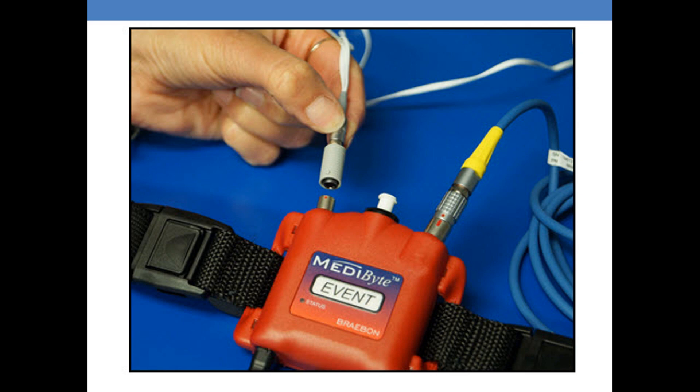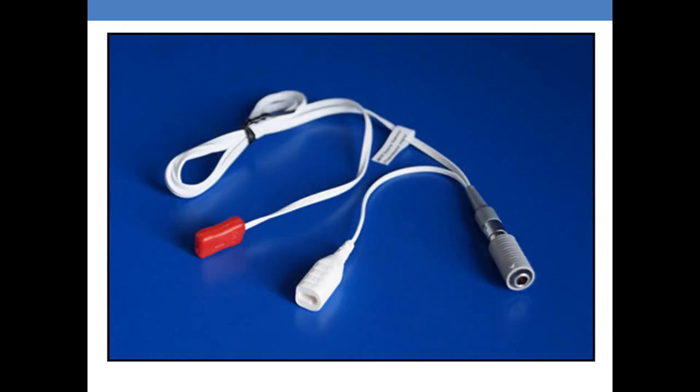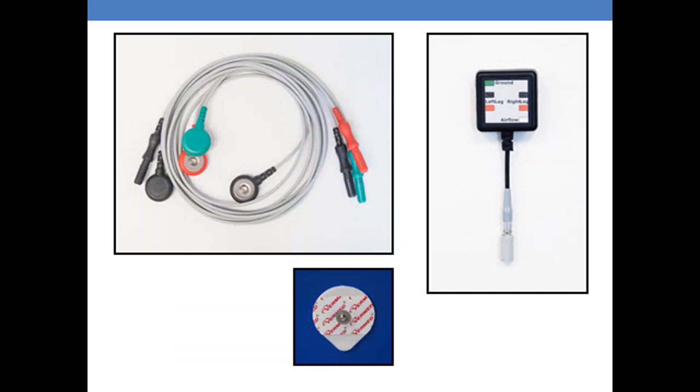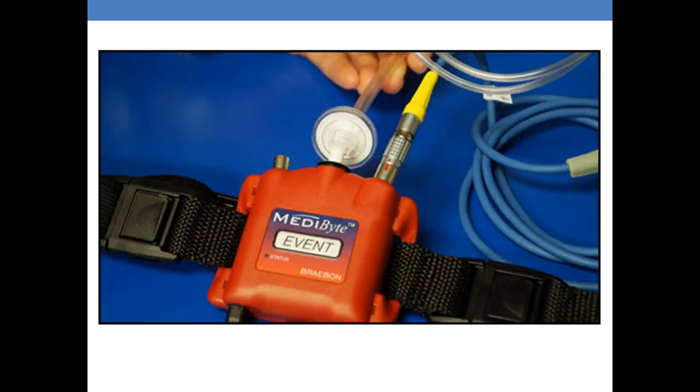The third port has a dual function. In this picture we're showing you how to insert the snore microphone. Independent of the snore microphone, you can also use what we call a yoke. The yoke is ideally used for patients when you are testing them for EMG.